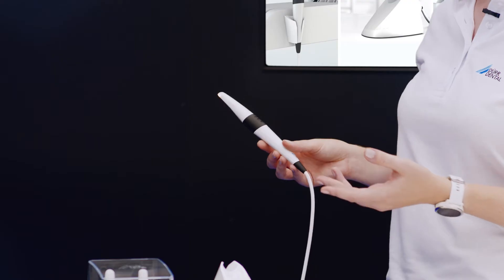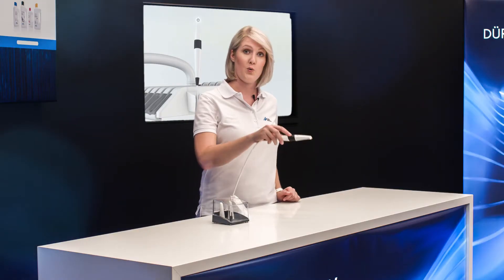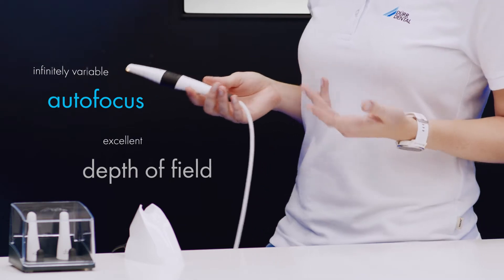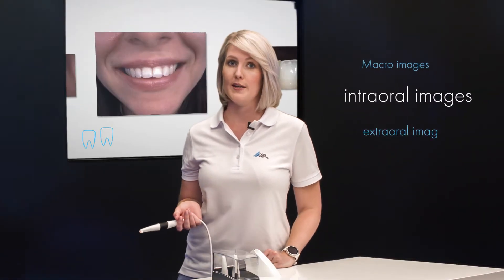Just press the capture button to record an image. These buttons are located on both the top and bottom of the Vistacam iX-HD Smart, making it even easier to switch between taking images of the lower jaw and top jaw. Autofocus is activated by pressing the focus button and covers the entire spectrum of images, i.e. from macro to intraoral and even extraoral.